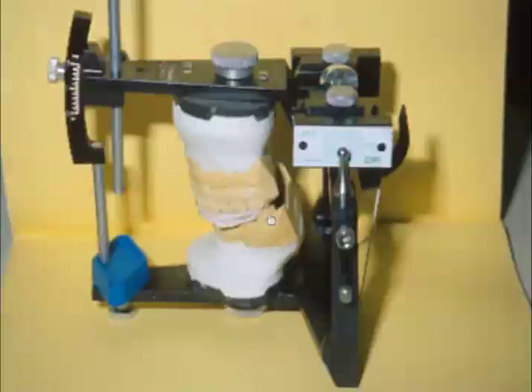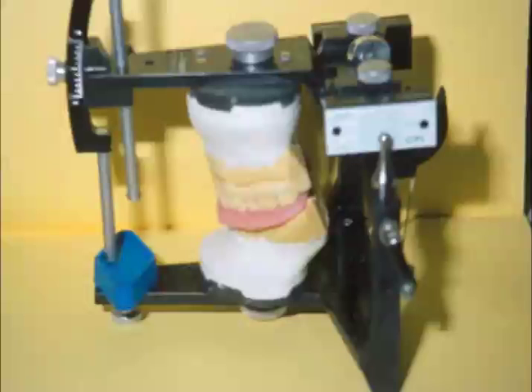So we have that record of the stable condylar position in here, and when we mark the graph, I again expect it to be back at the crosshair or centric relation of the articulator. Then we'll put in an MIP or CO record so we can see where the condyle goes when the patient bites their teeth together.